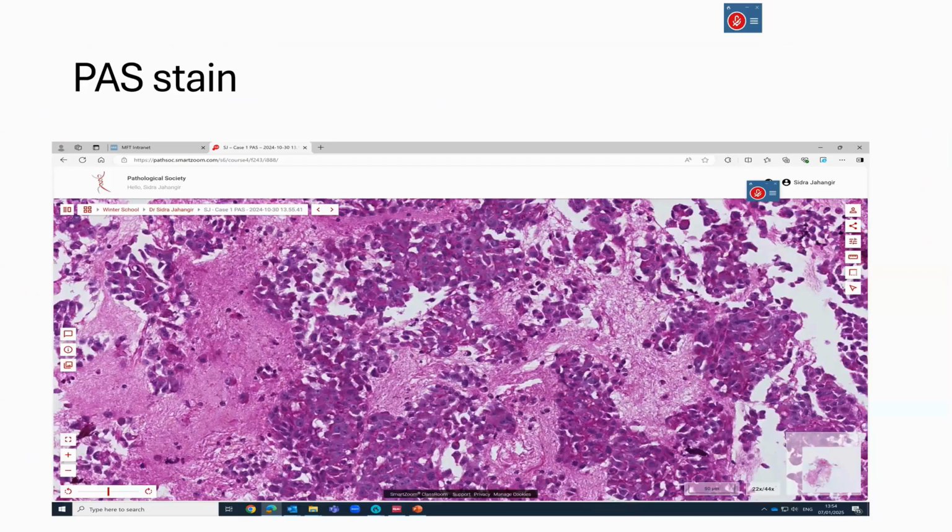So we threw a few immunos and special stains. Started with CK7. CK7 was negative, very patchy, very weakly positive. Morphology is not that characteristic for adenocarcinoma, so we are also thinking along other lines, because radiologically it's an aggressive looking 6 centimeter mass. So we are also considering other malignant diagnoses.